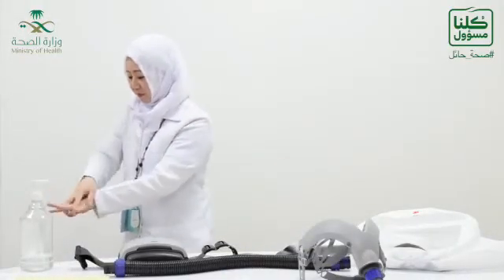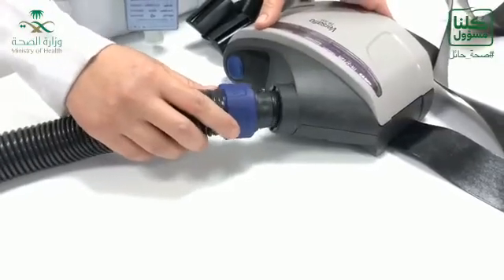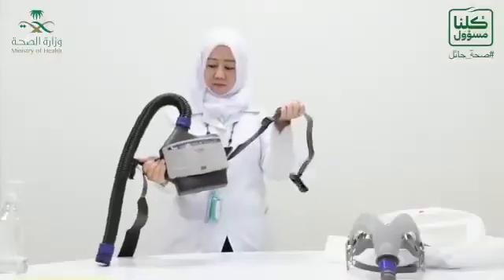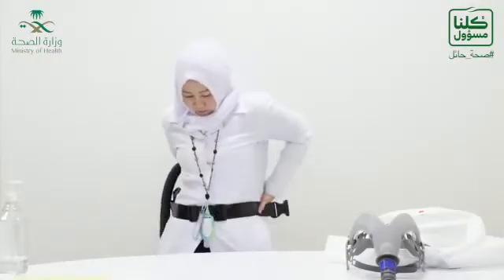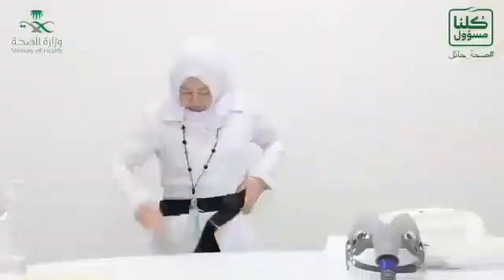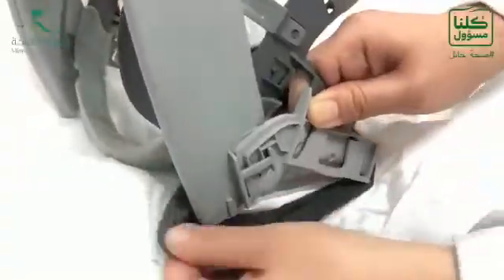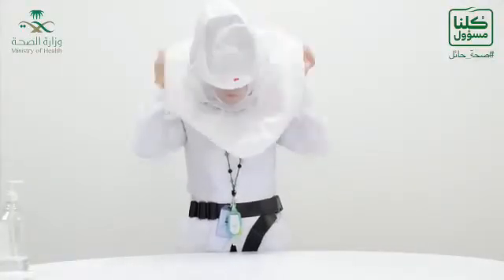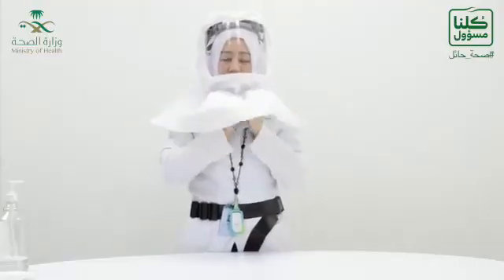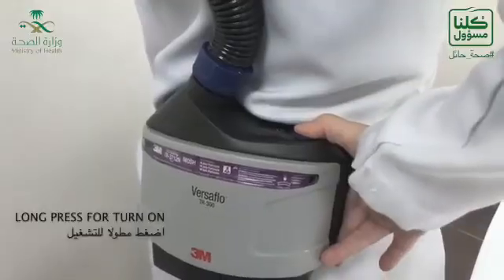You have to do hand hygiene before you start donning. Now you connect the breathing tube into the air blower, then adjust the belt according to your waist size — it has to be firm. Now you can adjust the hood with the head suspension by looking at the clip that you can see in the video. Then you don the hood and connect the breathing tube. Now you can turn on the power.